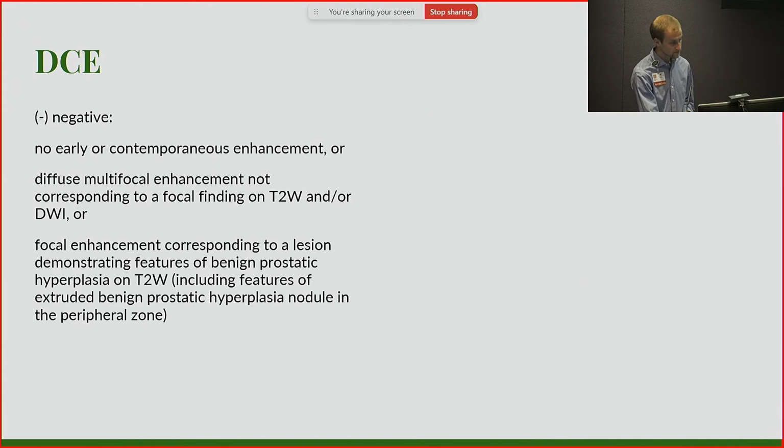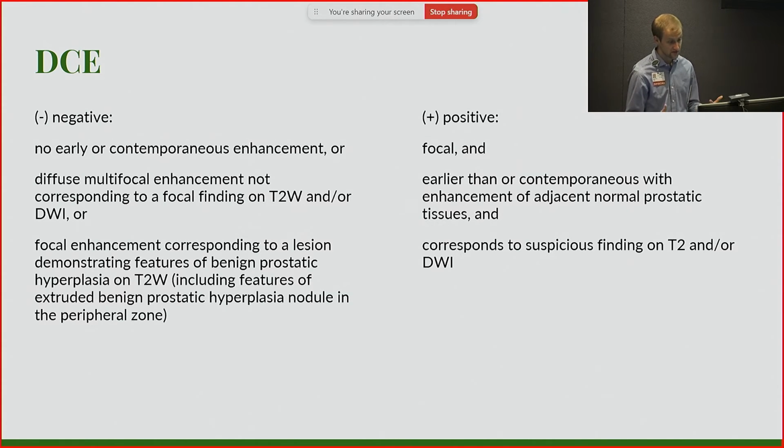The enhancement, really it's just either negative or positive. If it's negative, it doesn't enhance. If it's positive, it does enhance. And it's looking at whether it is focal in the area that corresponds with the lesion on the other phases, or is it early compared to that, and what's the correspondence?